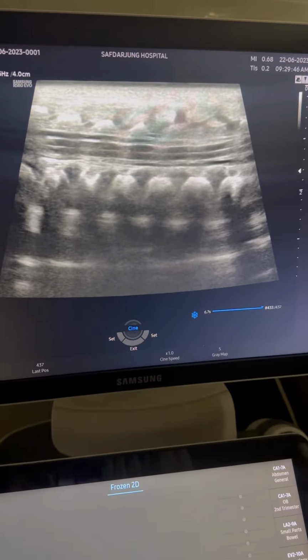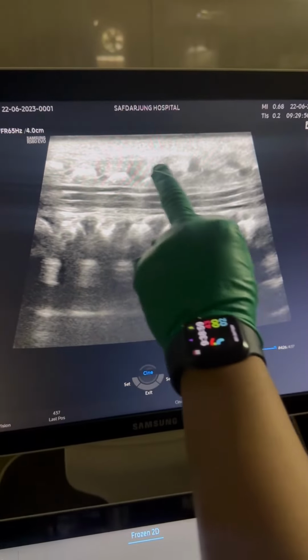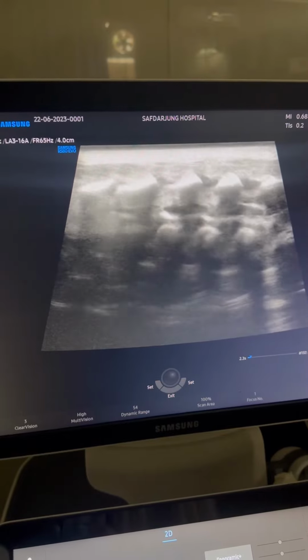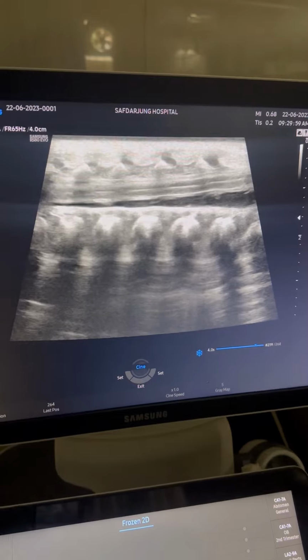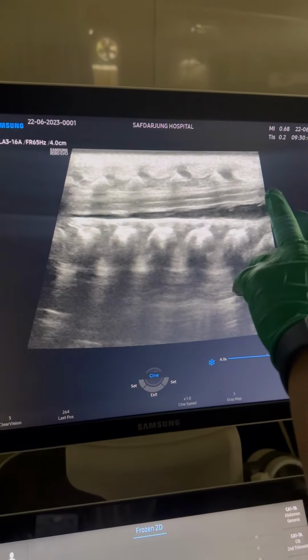These are the sagittal images of the dorsolumbar spine. The central canal within the spinal cord is normal, and the spinal cord shows normal morphology. The bony elements are also normal. But in the lower part, we see that the ventral thecal sac shows expansion, and we can see the CSF fluid as the black or anechoic area.